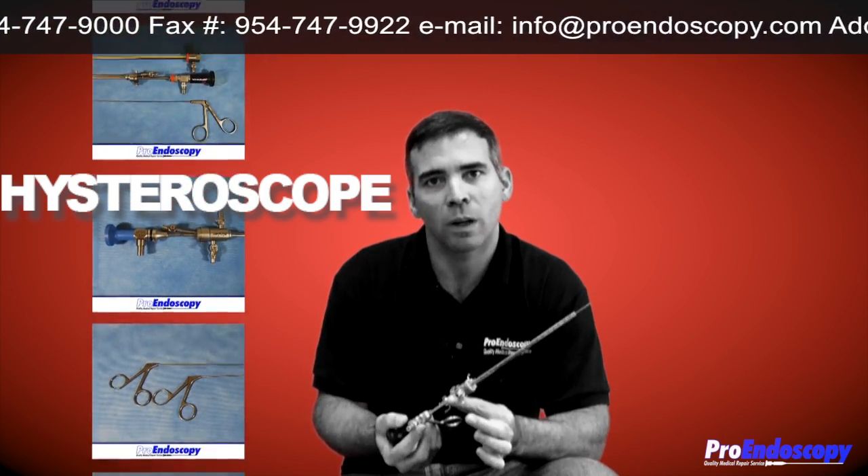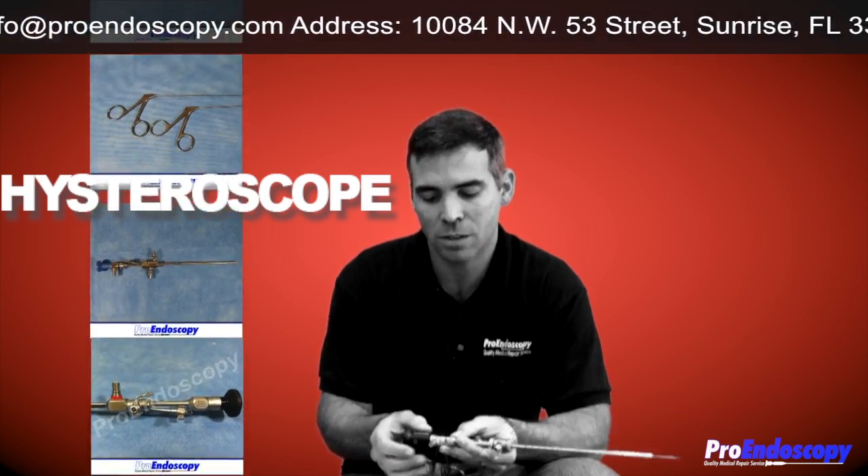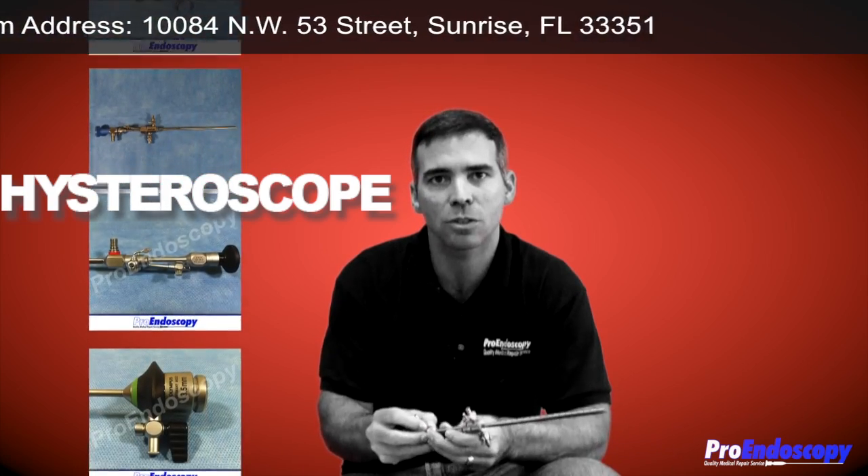A customer wanted to know about a Hysteroscope set. We have a Hysteroscope set here. It's a 4mm 30 Hystro ACMI.